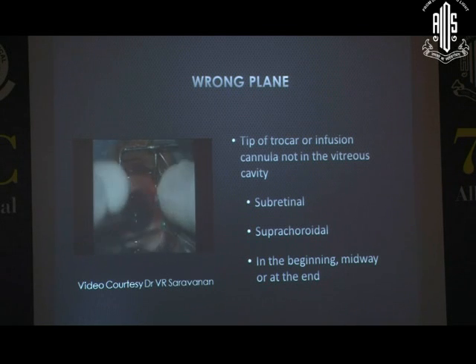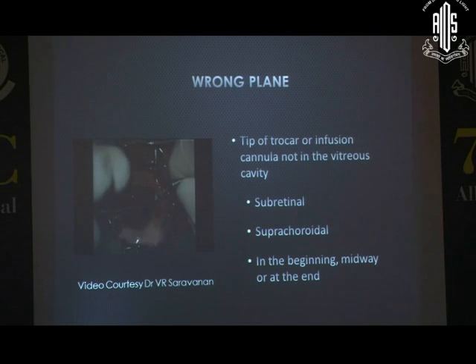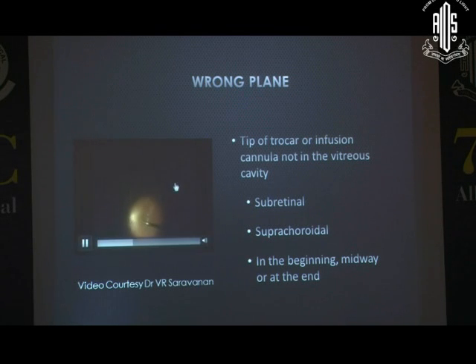So once again you have to confirm that your tip is very well into the vitreous cavity. Once you have confirmed that, you switch on the infusion and carry on with the case. If you have created a retinal detachment, you may have to drain the subretinal fluid. If you have created a choroidal detachment, you will have to drain that as well, if it is significant in size. In this particular case, the subretinal fluid was drained at the end of surgery from an existing retinotomy.